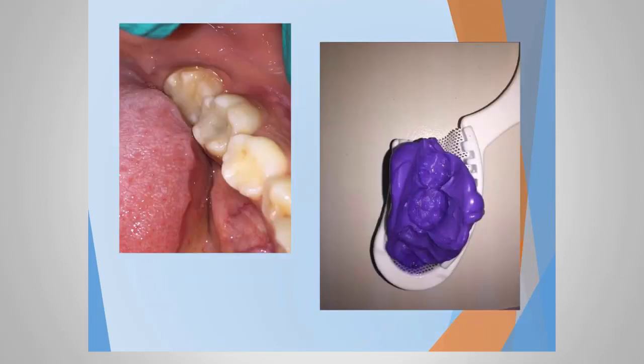So, another tooth, number 18, taking a triple tray impression. Again, the buccal margins are not really there, kind of washed out.